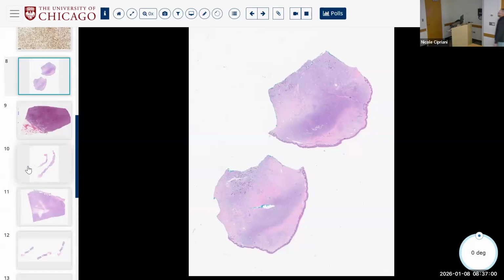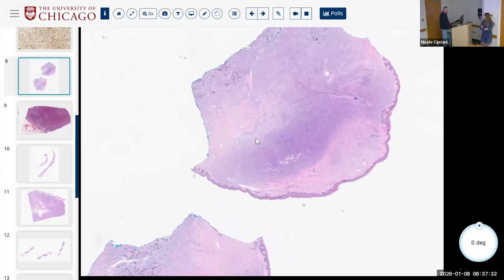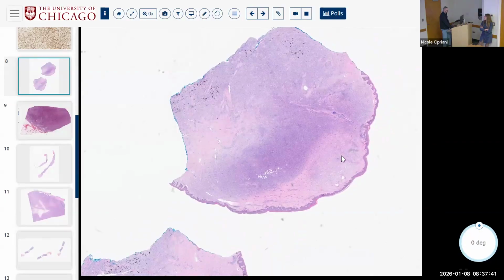Those of you who've seen these chunky skin lesions, half the time these tumors come to us from outside institutions as, patient has a cyst on their leg. It looks like something that's almost forming a papule of the skin because of this large dermal infiltrate. It's very blue, but there are some areas that are a little more clear. Here it's forming smaller nests perhaps. Epidermis looks okay.